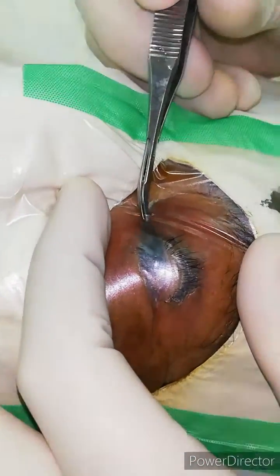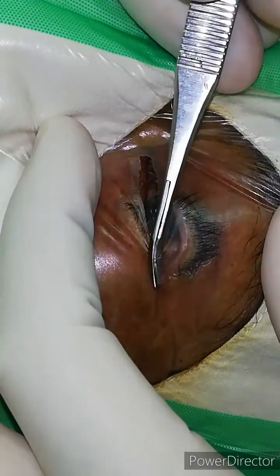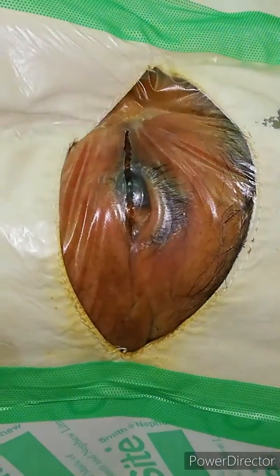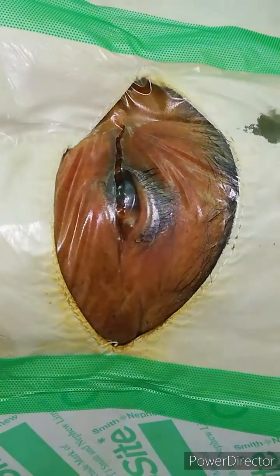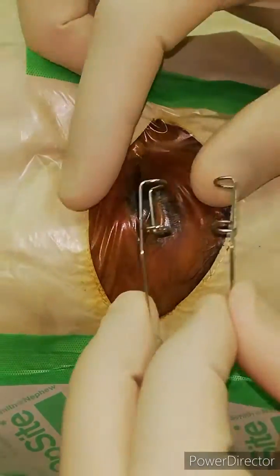Now give a small nick in the center and extend from the medial canthus to the lateral canthus. Care should be taken that it does not elevate from the skin. Give a small nick in the vertical direction immediately.